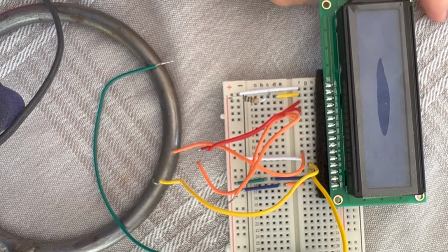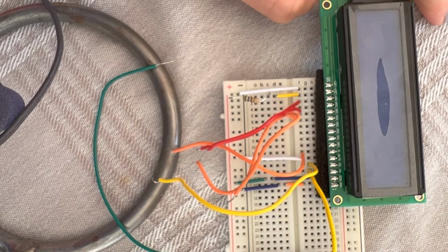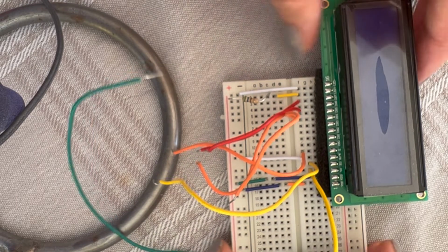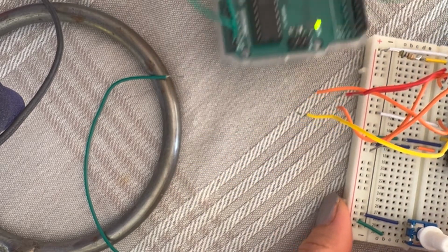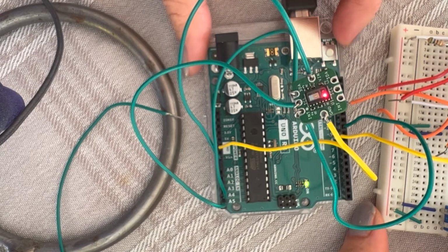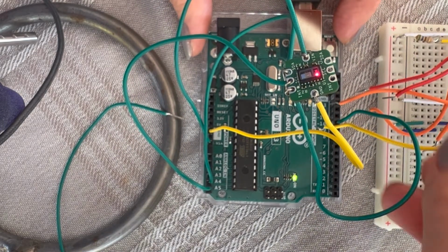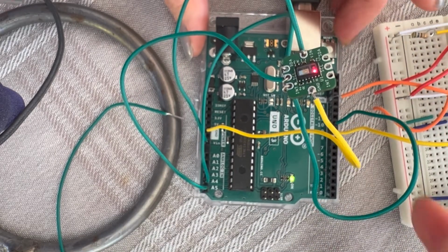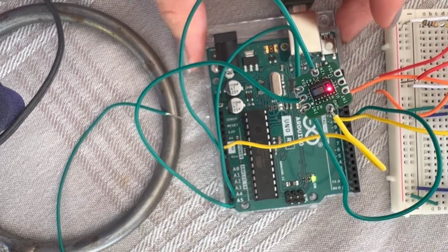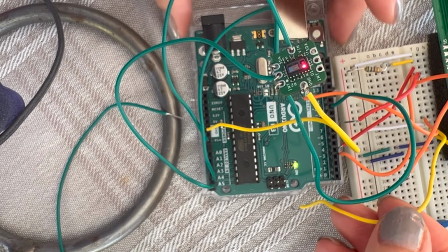If you don't have any resistors, but of course you do, because the starter kit has everything inside it. But yeah, that's it about the LCD. I hope it was a good explanation, but let's go and connect this. I don't connect the ground and the breadboard to the current until I complete the full connection.